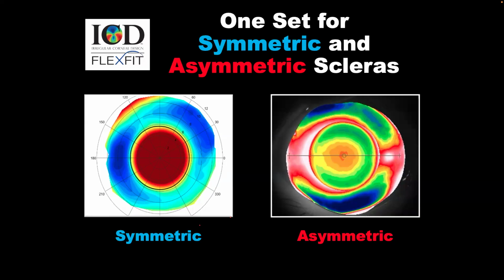The CAT design group with Randy made studies with the Pacific University, and they found that 125 microns works most of the time with those types of scleras. Like mentioned before, if I'm doing a 17, I would go a little bit higher on toricity and make it 200 microns. But that's me, and every practitioner has their own mindset. It's up to you, by doing a good assessment on the slit lamp.